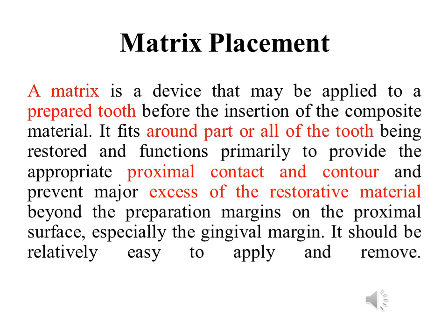مثل أملغم عندنا بحالة كلاس 2 نستعمل ماتريكس باند اللي ميتال وريتينر. هون عندنا ماتريكس بليسمنت. Different types of matrix نستعمله مع الكومبوزيت also to help the composite restoration inside the cavity and to prevent the slip.